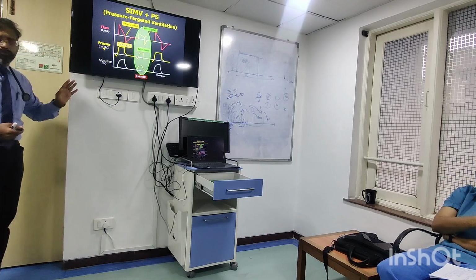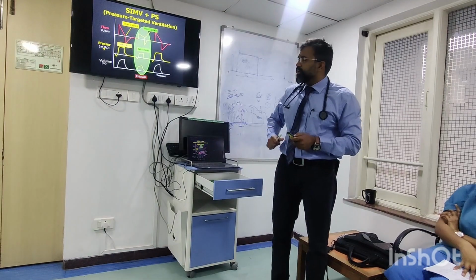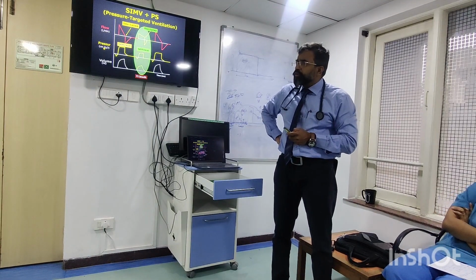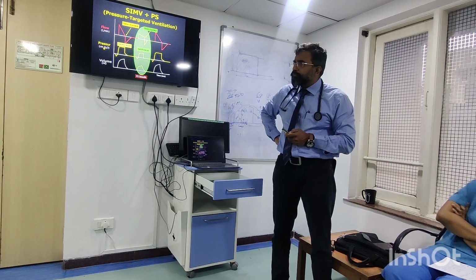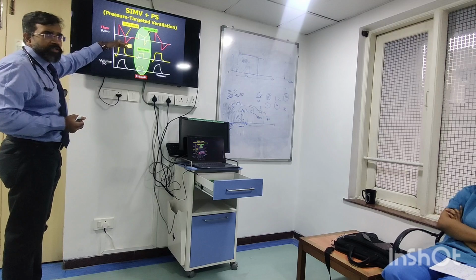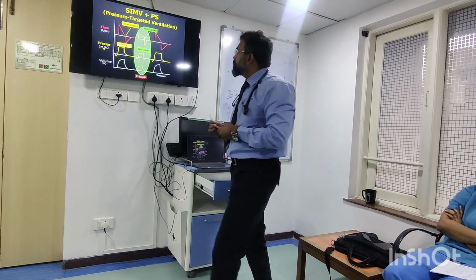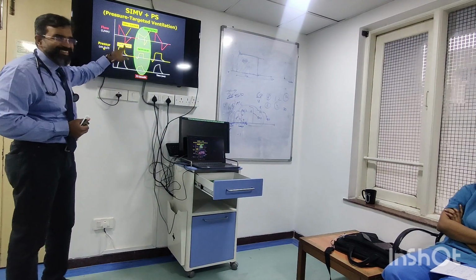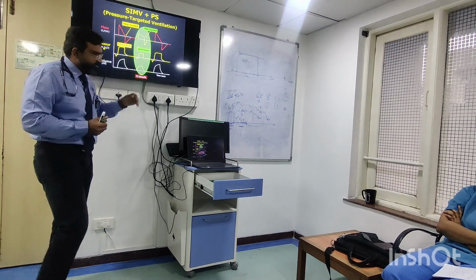Now what is happening? What is the first breath type? Let's take the first one. In the first breath type, there is trigger by the patient. Patient trigger, okay. Limit is also pressure, because the cutoff which is there from the flow. No, one second. Yeah, pressure will be the limit. Pressure is the limit because it is going up and it is constant here. It's limited by pressure and cycling is time, because it is written also, you know, time cycle. So that the cutoff is also there. So actually it's time cycle. And what is this breath type?